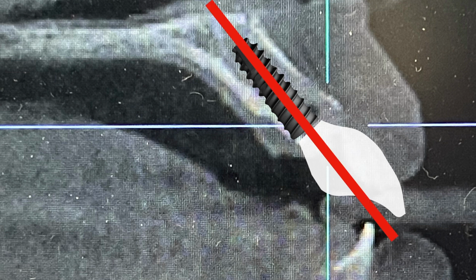So that is the long axis, and according to that long axis, that should provide a cingulum screw access hole. Whether you do screw or cement retained, it doesn't really matter. You really want that to be over there for a number of biomechanical and biological reasons.